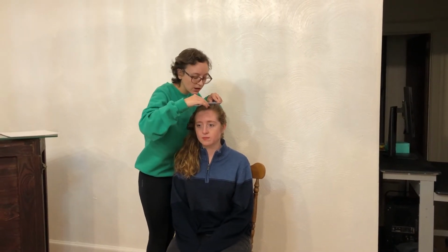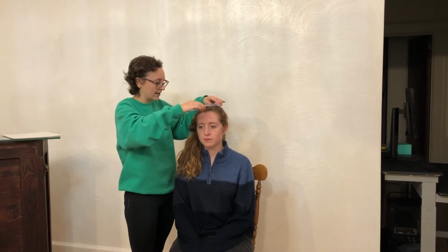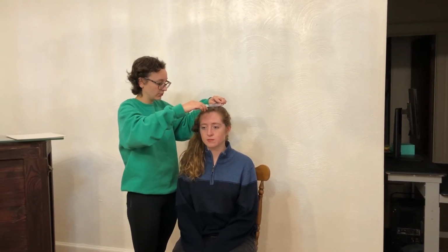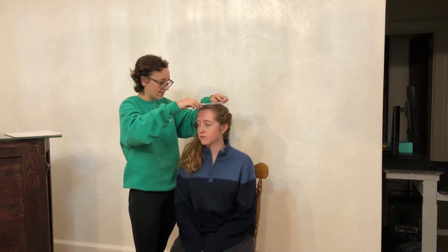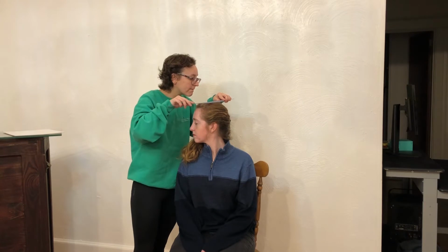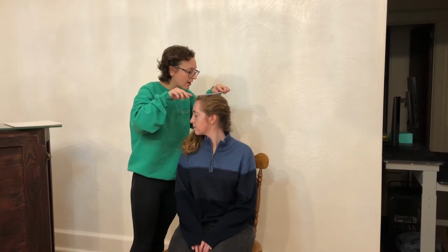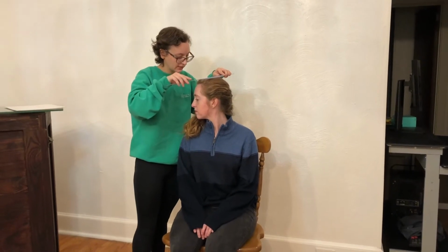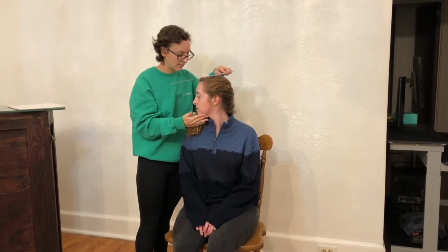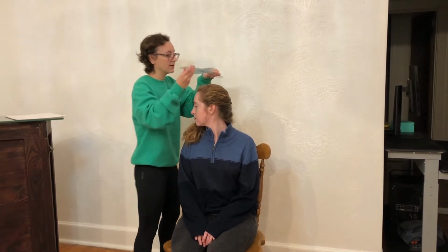Okay, so now what I want you to do is go ahead and turn your chin over to your right shoulder. Okay, so we've got about 41 degrees. I'm just going to see if I can't bring you a little bit further. Fantastic. Okay, now for the other side.